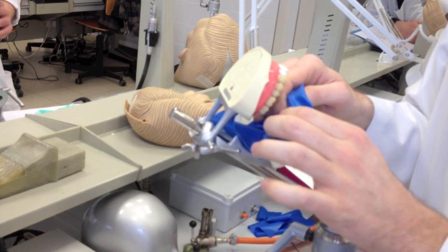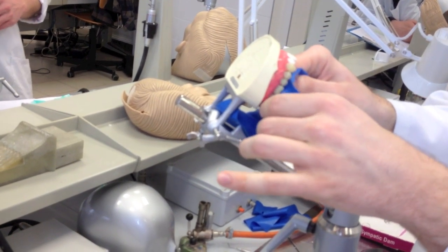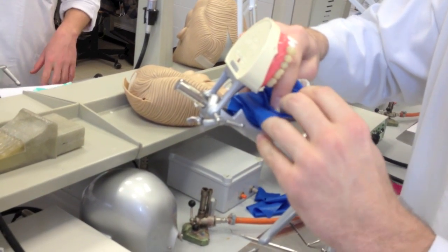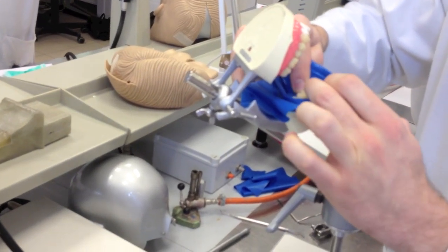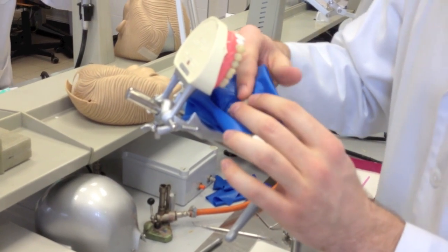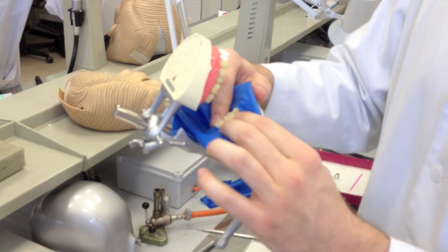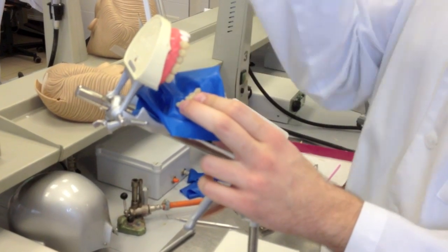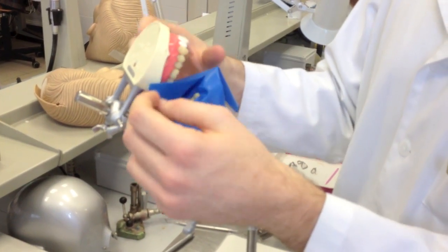After that, place it on the six. And then you can place it on the five. It's a bit difficult for these plastic teeth because they are so dry and the rubber sticks to them. For the endo pre-exam you can use lubricants. In patients you don't really need to use lubricants, because there is a lot of saliva which will make it easier to apply.